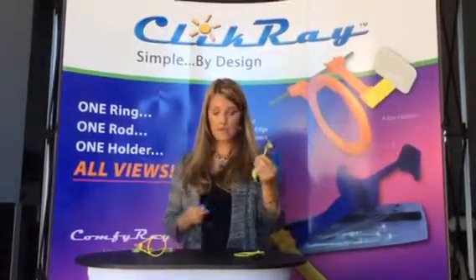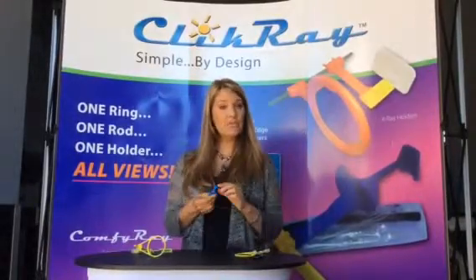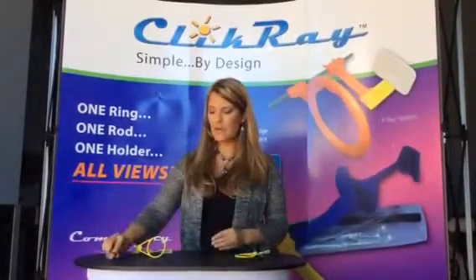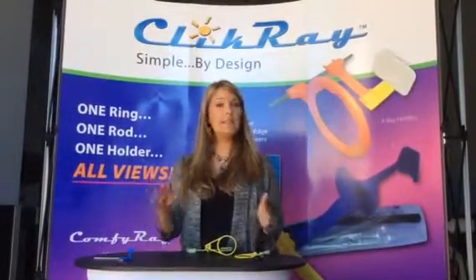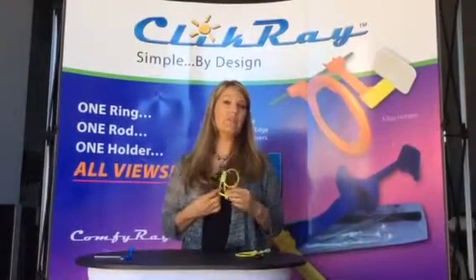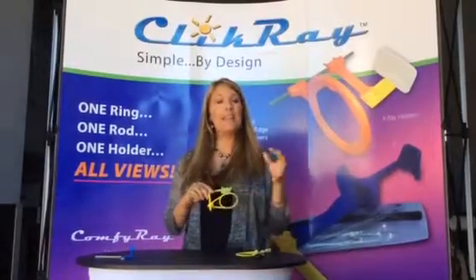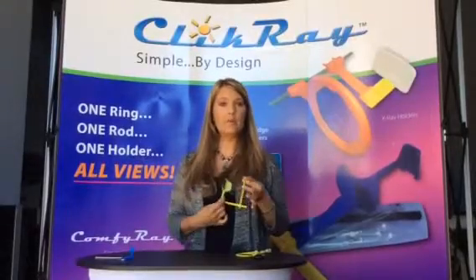The other thing I want to address is the durability of this particular system. These units are made out of the same material that your bite blocks are made out of, so they're going to last just as long. You don't have to worry about broken pins like you do with metal systems. Most metal systems in offices today retail for about two hundred and fifty dollars, where this particular system retails for about fifty dollars — and it's going to make your life a lot easier.